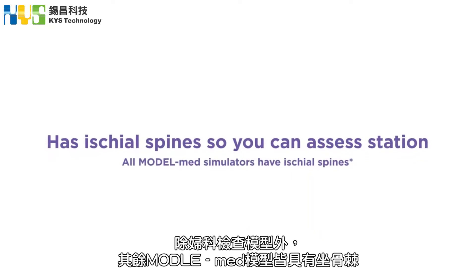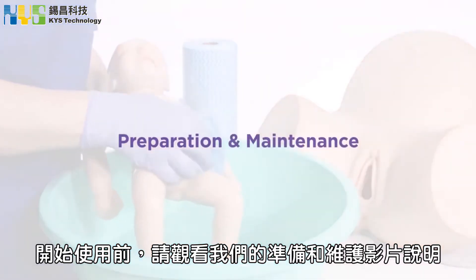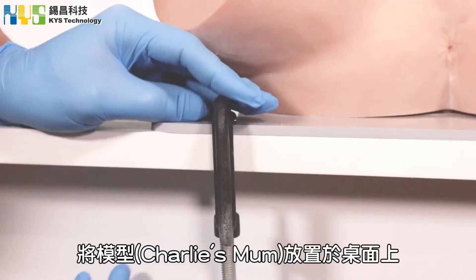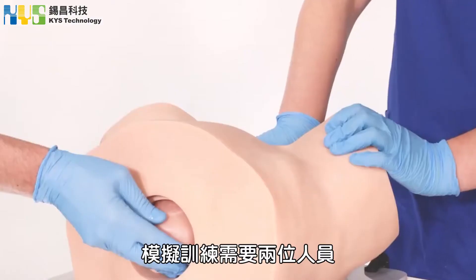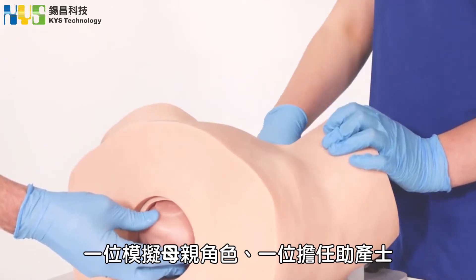All ModelMed simulators have ischial spines except for the gynaecological trainer. Before running a simulation, please watch our video on preparation and maintenance. Place Charlie's Mum at the front of the desk. You are going to need two people to complete the simulation — one mother and one midwife.